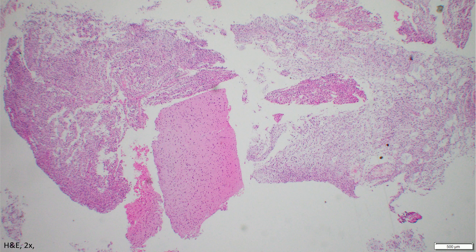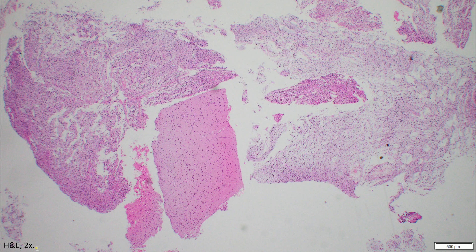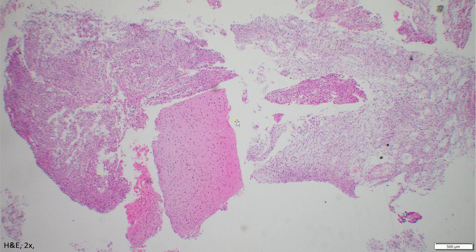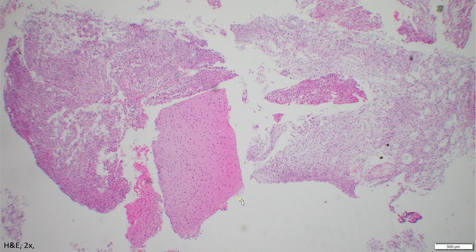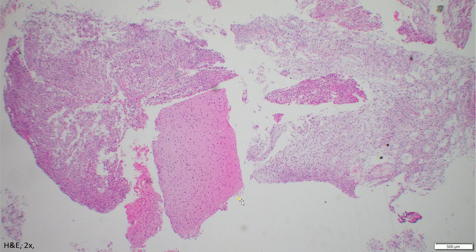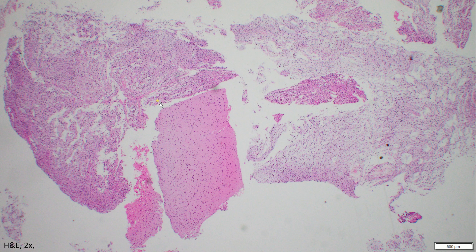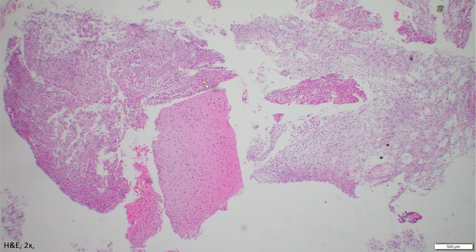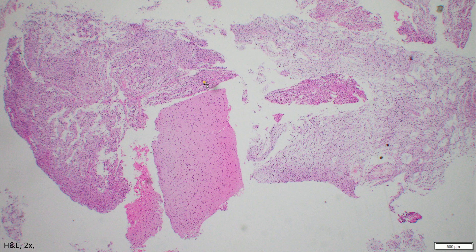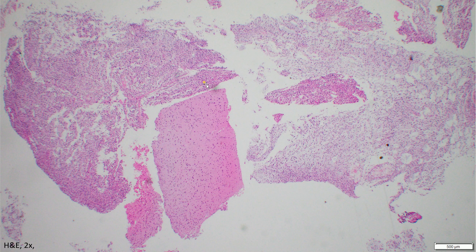The neurosurgeon went in and took a biopsy of this lesion and this is what we received. This is a low power view taken at 2x, and what it shows here is that there is a piece of recognizable brain tissue that looks to be involved by tumor but still has retained its general architecture. Surrounding this fragment of brain tissue are areas of frank tumor, and on low power the cells appear monomorphic with an oligodendroglial appearance — very round, very uniform nuclei.